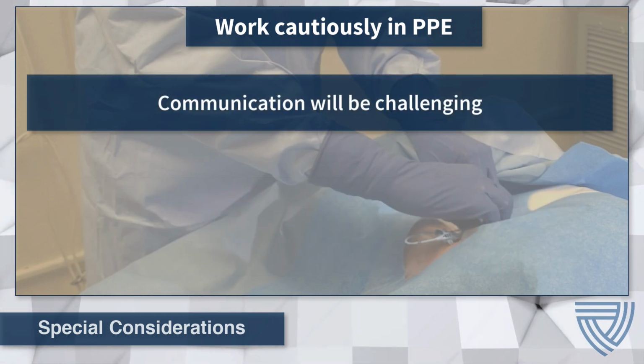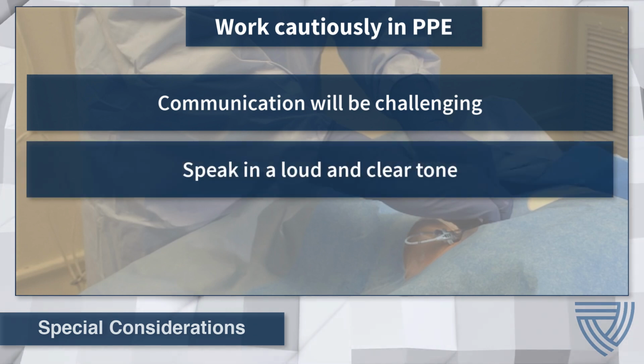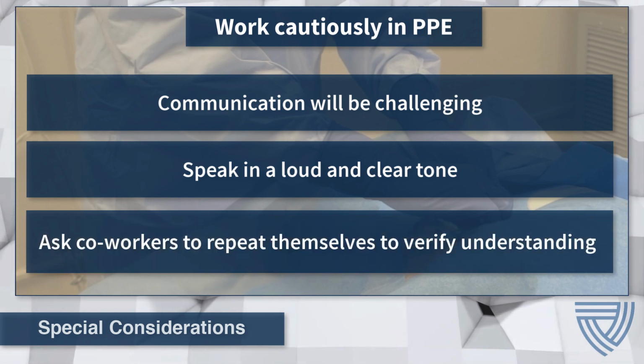Communicating with team members during the central line procedure will be challenging. Wearing PPE can be noisy and muffle sounds, making communication difficult. Healthcare workers will need to speak in a loud, clear tone and be prepared to ask coworkers to repeat themselves to verify understanding.